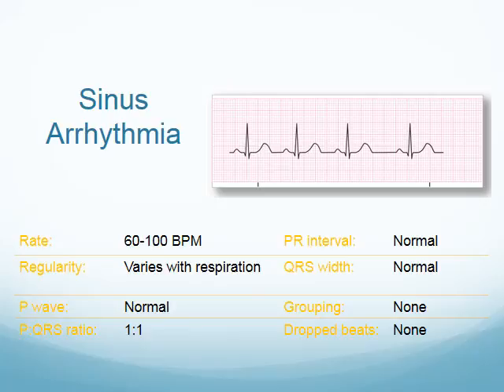So here we have our example of sinus arrhythmia, and later on we'll have a better example of this as we look at some longer practice strips, which helps you see the pattern.